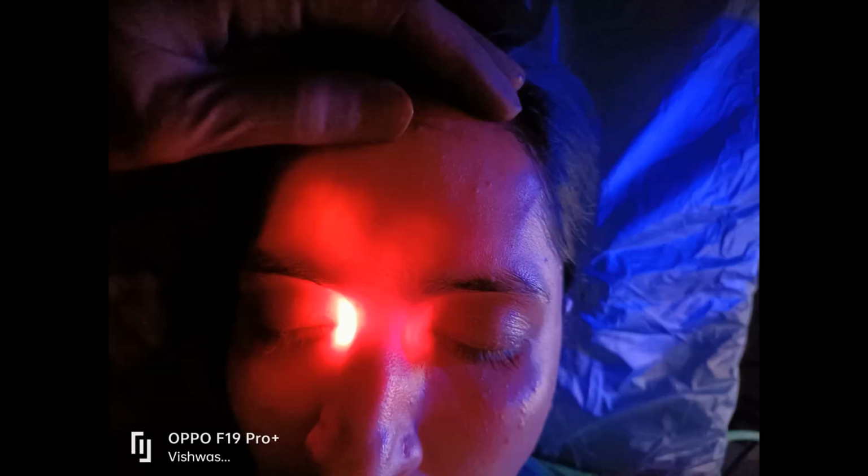So you can see two bright spots on this second image right now. The lower one near the medial canthus of the eye is the place where the tip of the endoscope is present, and the bright spot above that indicates the place where the light is being hit on the bony wall of the sinus. And the rest of the light is just the reddish hue of the frontal sinus, a diffuse light inside. That's the third photograph. You can see a brilliant illumination of the frontal sinus that indicates that the surgery was a huge success, and the patient is free of fungus right now.